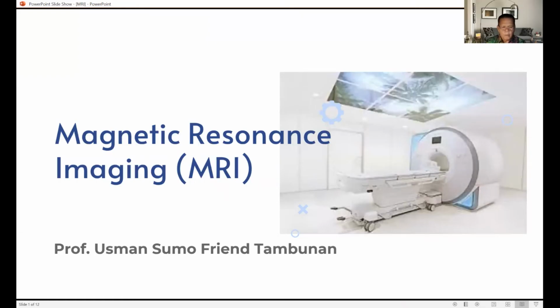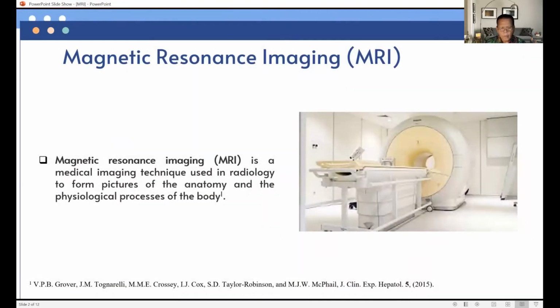Morning. This time we will discuss magnetic resonance imaging, or MRI. Magnetic resonance imaging, or MRI, is a medical imaging technique used in radiology to form pictures of the anatomy and the physiological processes of the body.